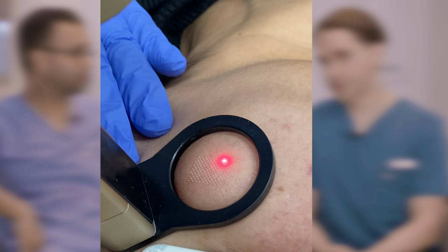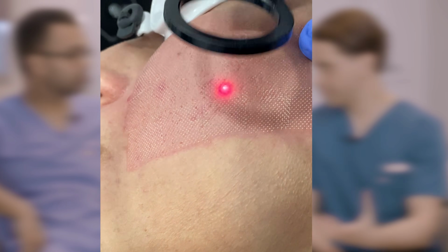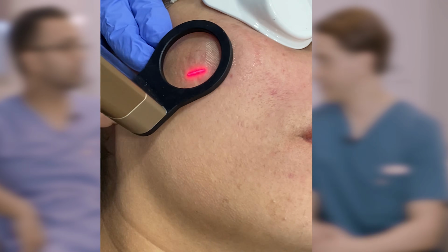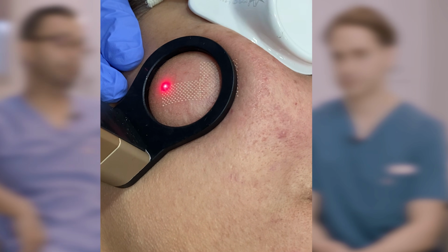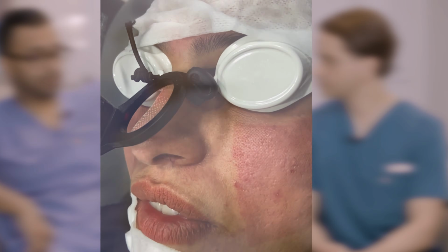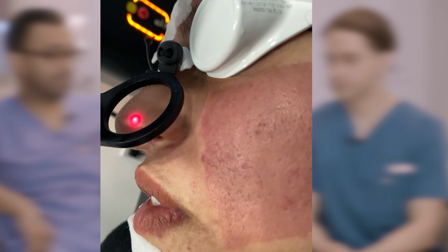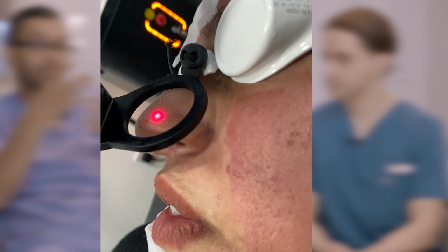Yeah, that's the key. So it's a double function of the laser: to not only cause that injury that we talk about in other videos to stimulate collagen, but you're also physically polishing the skin. Absolutely. Some of the traditional CO2 lasers were fully ablative, which basically means all the energy was applied almost as a stamp. Nowadays, we have pixelated lasers which are fractional, so you've got those little pin dots, almost like the dots on a dice, and they leave tissue that has not been treated. So you get shrinkage, and the downtime is not a lot.